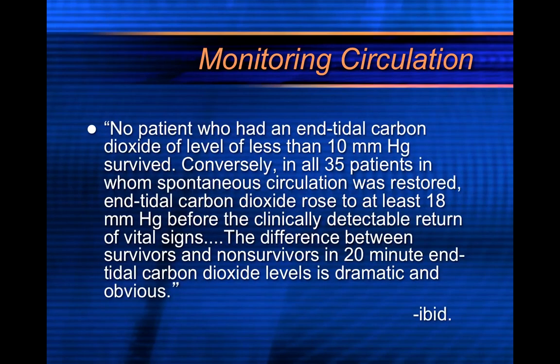More research shows that nobody in this study survived with that condition if they had values of less than 10. But in all 35 patients who did survive, they had values of at least 18 before they had a detectable return of vital signs, so of a pulse.